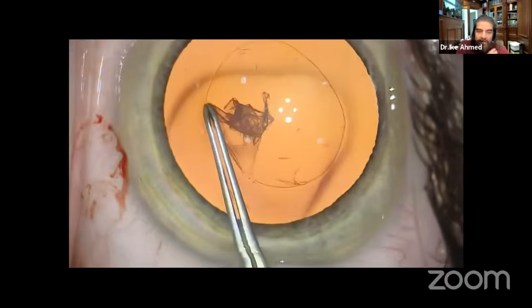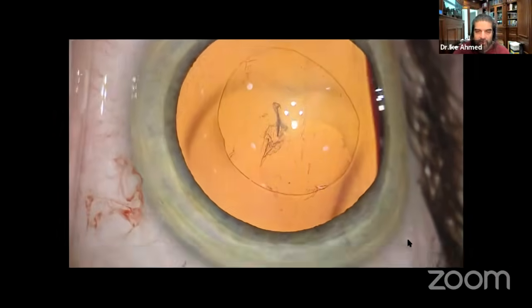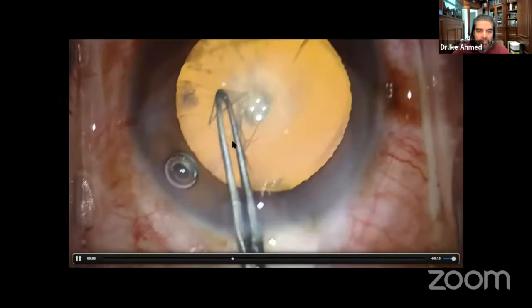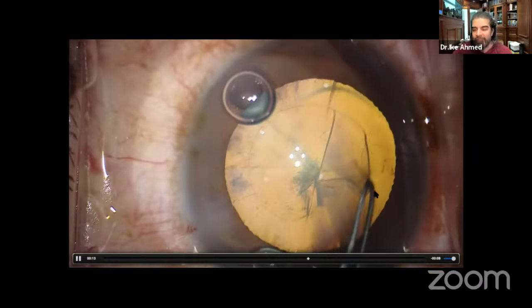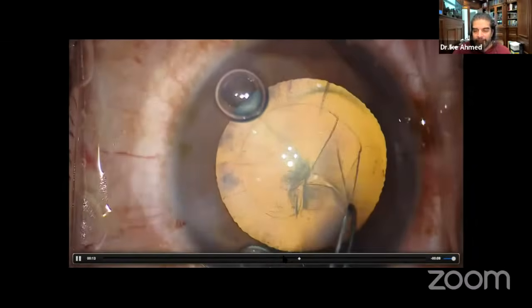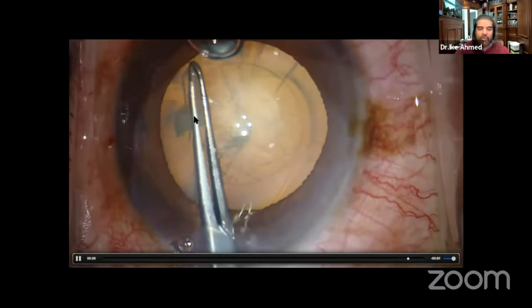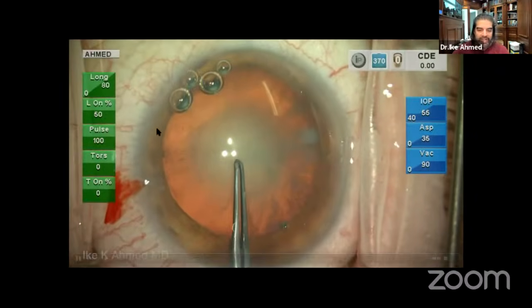And regrasp, again, about maybe 1 millimeter to 2 millimeters from the apex of the tear. Continue the rexis. And if you look at the rexis, when we tear with shearing, you can actually see that the forceps itself is basically outlining the direction of where we're going. In a usual case, you can see how the rexis is being propagated, and the forceps are following the same contour of where the rexis is going to tear. This is a good way to approximate the vector required. You can see the forceps are tracing the outline of where that tear will go. Frequent regrasping is helpful.